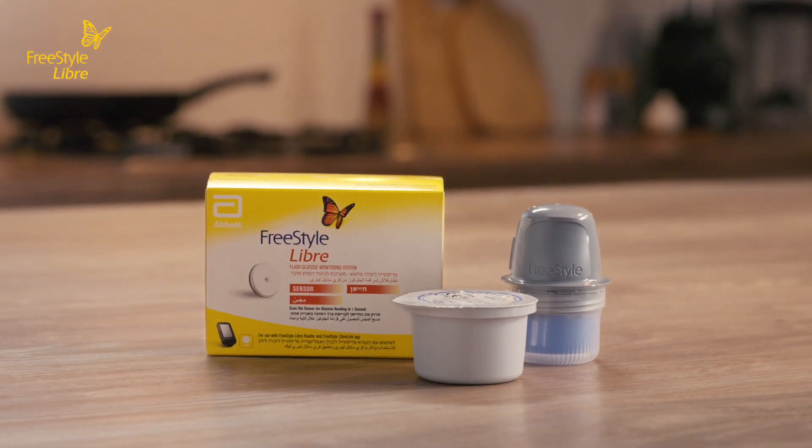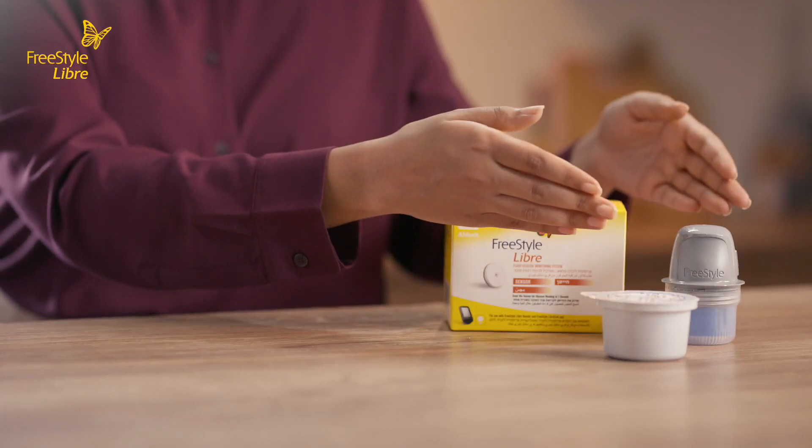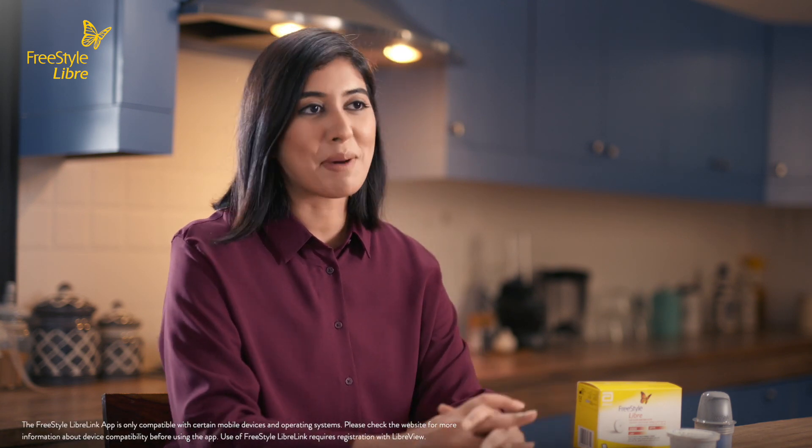Hi, today I'm going to get you started with the Freestyle Libre, a continuous glucose monitoring system. Let's go through the main components of the Freestyle Libre system. We have the sensor pack and the sensor applicator. You can also use the Freestyle Libre link app to check your glucose levels simply from your smartphone.